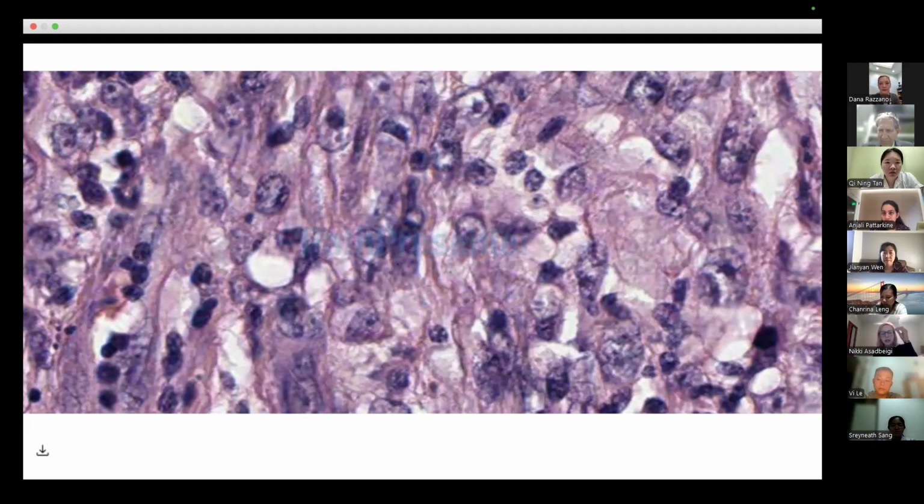So it's helping with melanocytic lesions, but it's not going to be 100%. One of the worst things about it is that it's negative for desmoplastic melanoma, and that's one of the things we usually need help with. So for me, whenever I'm between severely atypical dysplastic nevus and melanoma, and if I see it's PRAME positive, then I'm going to call it melanoma. That's going to help me. But it's not going to be positive in all of the melanomas, and not everything which is PRAME positive is going to be melanoma. It's helpful, I think it's more helpful in the borderline lesion when you're thinking about it.